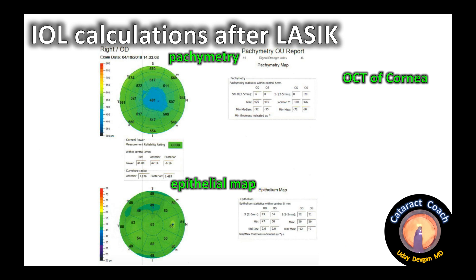Now we're looking at an OCT image of the cornea. The top half of the page is the pachymetry — how thick the cornea is at any given point. The central cornea here measures 481 microns, consistent with the ~500 microns from the previous machine. It also gives us the posterior corneal power, which is about minus 6 in most eyes. Remember: LASIK and PRK only change the anterior shape of the cornea — they don't change the posterior shape or posterior power, unlike RK, which changes the entire cornea front and back. The bottom section is the epithelial map.